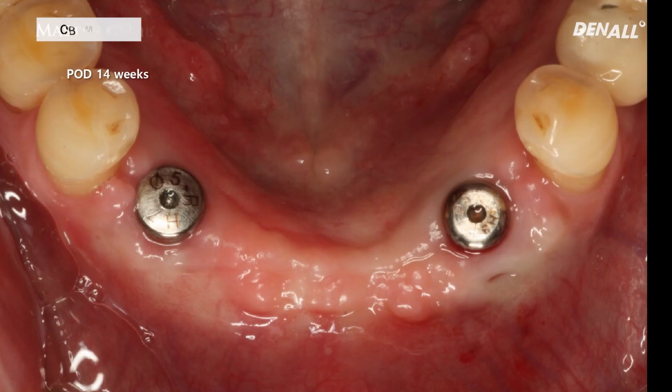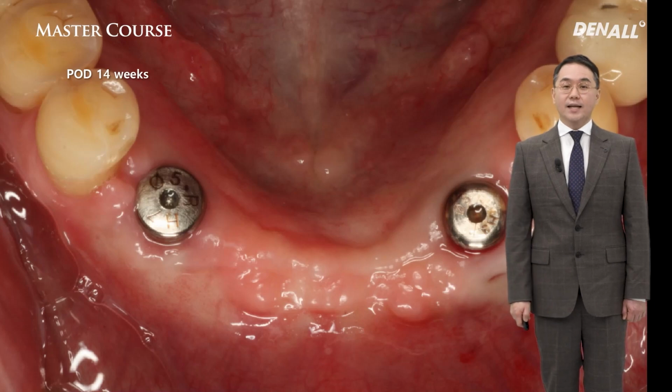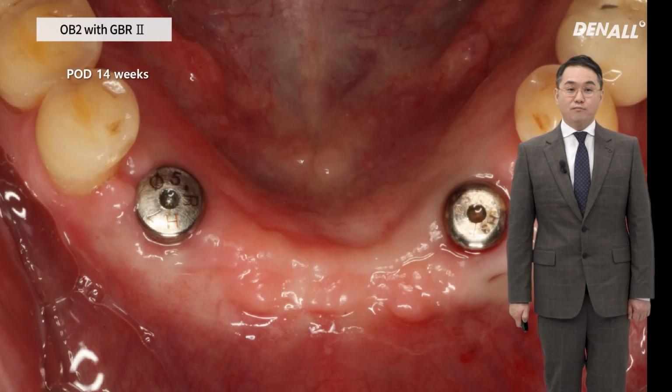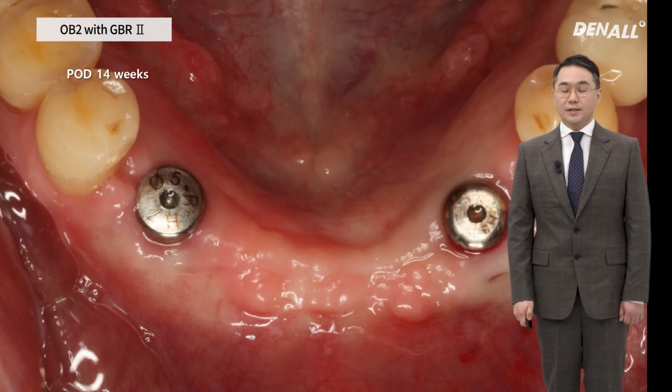This is post-op 14 weeks. This is how it was healed. As mentioned, non-submerged GBR, if you do that on the buccal side, the keratinized gingiva can be preserved. Vestibule depths can be also maintained, therefore soft tissue aesthetics is very excellent. Ossbuilder was not exposed and soft tissue healing occurred nicely. On the right side, a resorbable membrane called Osguide was used and therefore secondary surgery was not necessary.